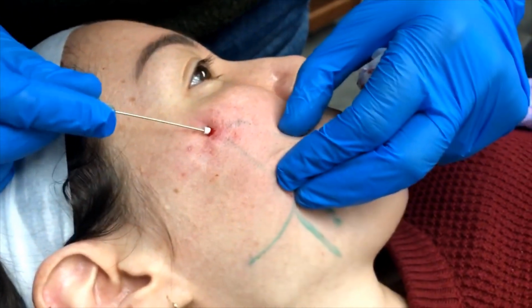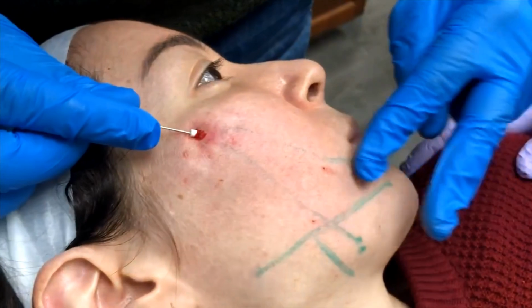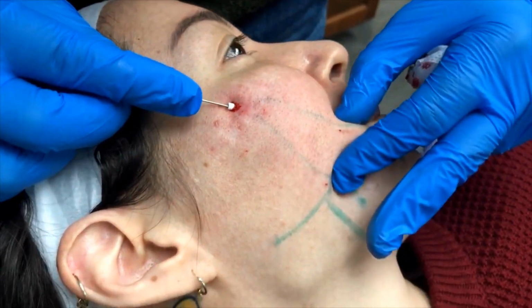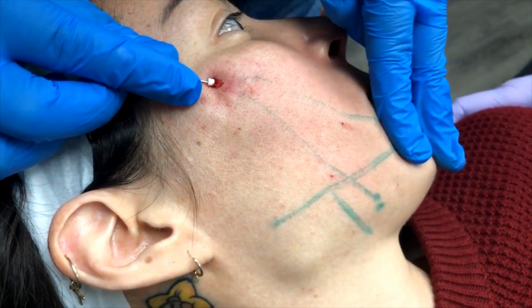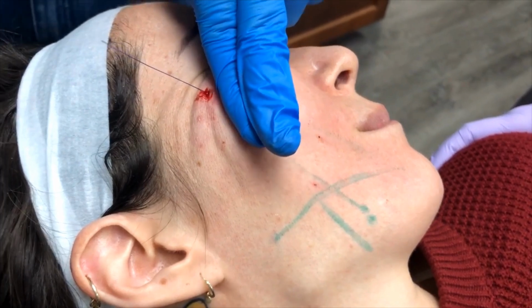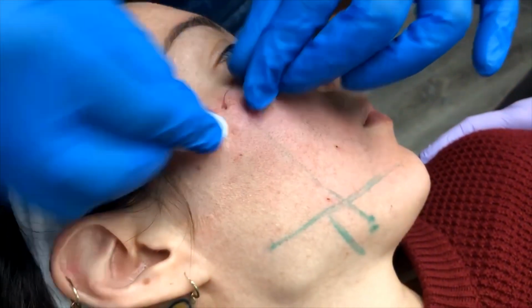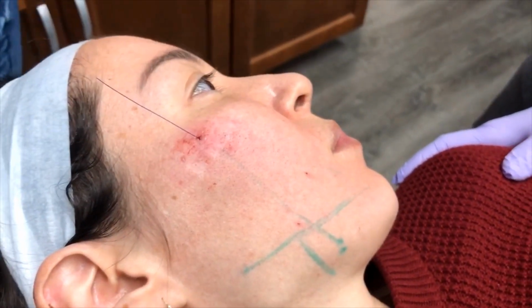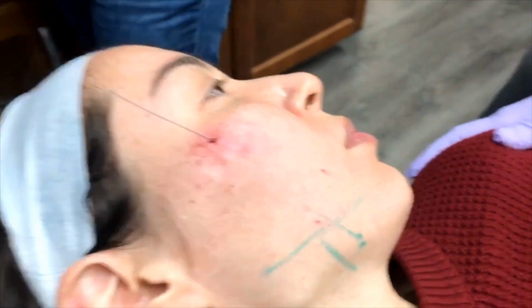So what are we doing? We're going along that same track that we made with the ComfortDocs microcannula. Look how simple that is. Curtain over the curtain rod. We always know where the tip of our instrument is. Now we're going to exaggerate that tissue and come straight out. Look how quick and easy that happened to place the actual thread here with just a little preparation, and comfortably. You've seen the patient has not stopped talking throughout this entire procedure and has been talking to the injector.